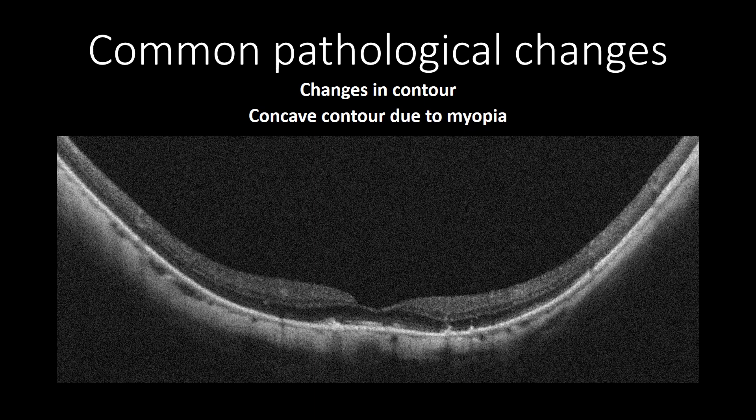In myopia, changes in contours can vary, and I will dedicate a full presentation to myopic changes. However, the most common changes are concave, which can be regular or irregular. This OCT cross-section shows concave shapes symmetrical on both sides of the sclera, which is curved posteriorly symmetrically around the fovea. In a nutshell, whenever there are concave contour changes, myopia should be suspected.